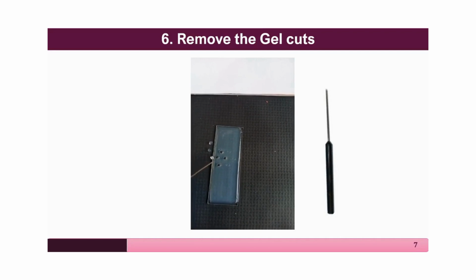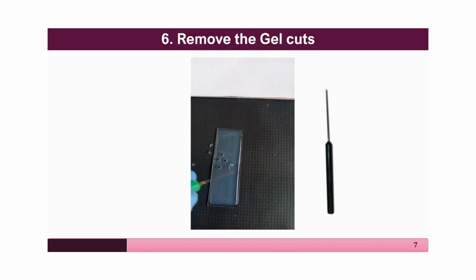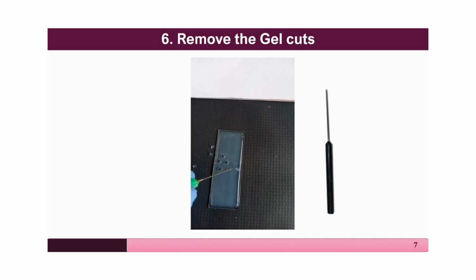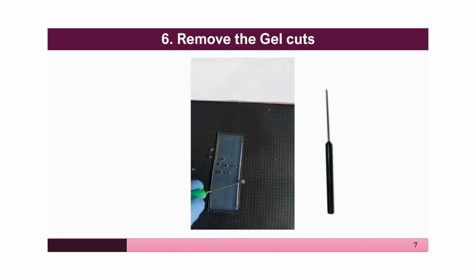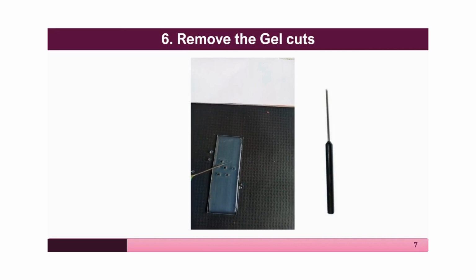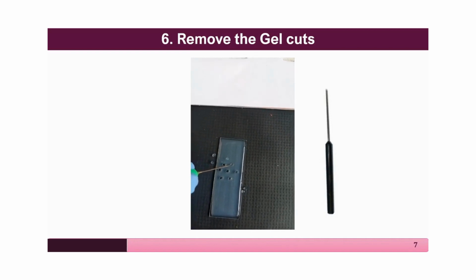You can see in the photograph now, in the video, how the agarose is removed. If a sucking pressure of the rubber bulb is not sufficient, this is how you will get the wells created, but agarose does not get sucked. Therefore, you must exert sufficient amount of pressure using the rubber bulb.